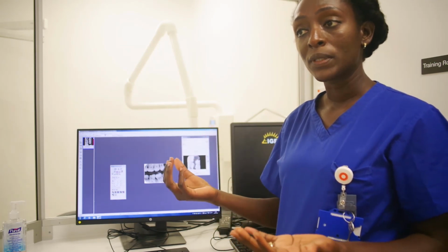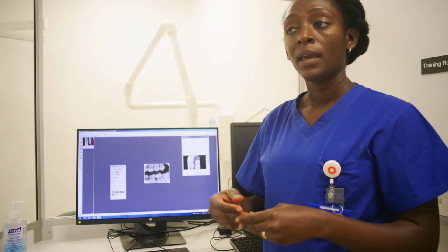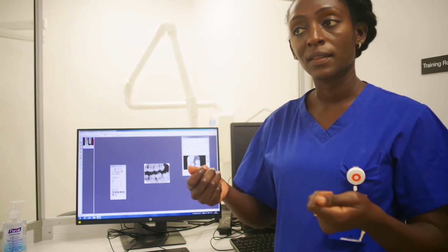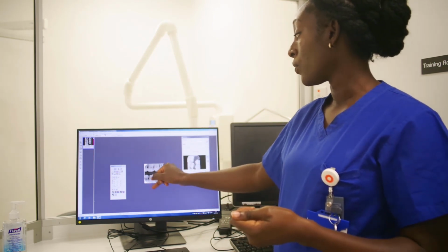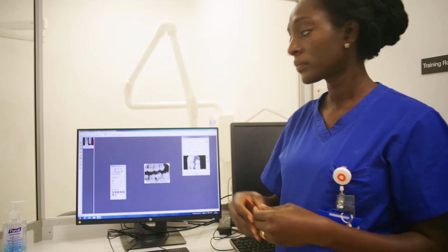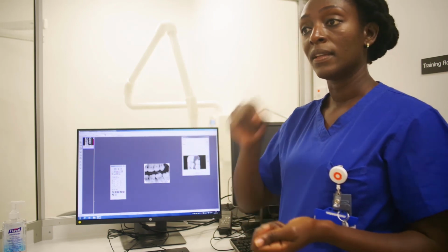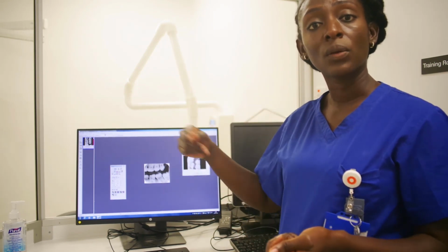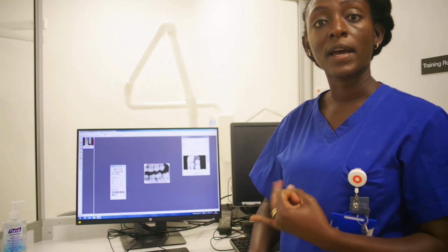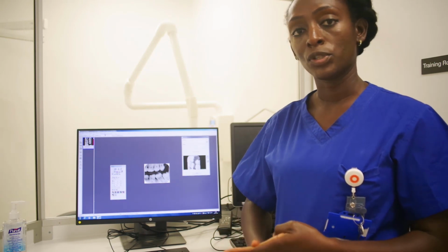In terms of processing, what are some of the processing errors that you might come up with? If I'd exposed this to light, as Mark discussed in the lecture, some aspect of it would be white, so you'd see the difference in contrast. Also, if I haven't scanned it well, the laser light will make some sort of streaking on there, but we don't have any of this sort. So preparation is fine, there's a bit of error under positioning, processing is fine, and exposure is fine.